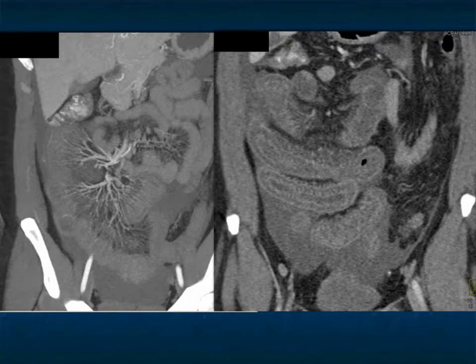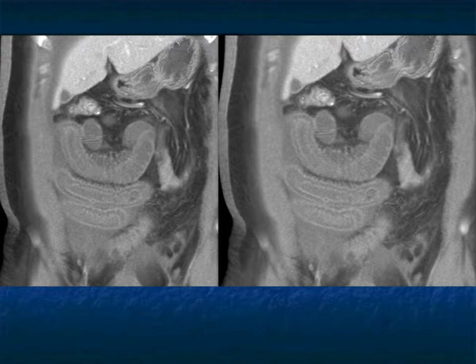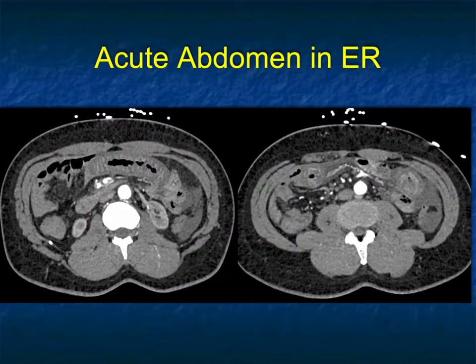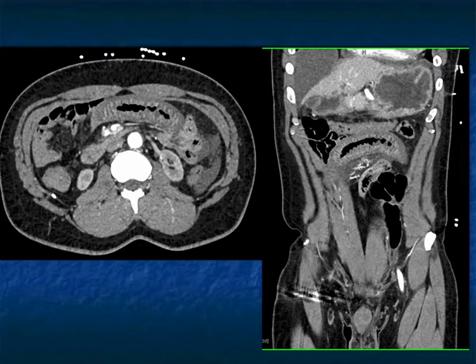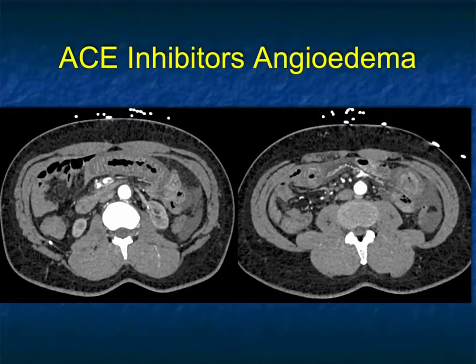Looking at the images on the right, you can see how similar it is to some of the other things discussed in this series. The importance of thinking about what the patient is being treated with — often the clinicians don't think about it. It's your job to at least ask the question: is this patient on ACE inhibitors? Another patient, same thing. Look at the thickening of the small bowel. There's ascites present. Changes related to ACE inhibitors can include ascites, thickened bowel, small vessels. ACE inhibitor-induced angioedema.